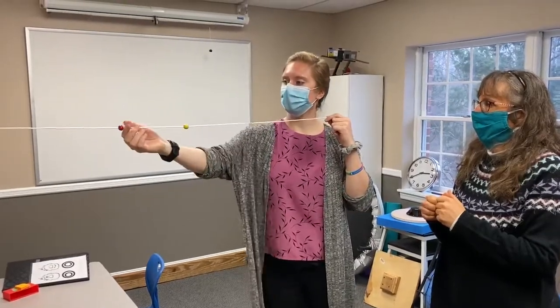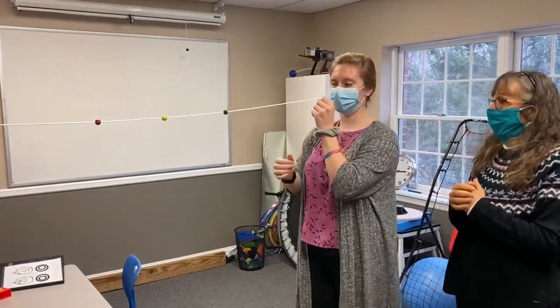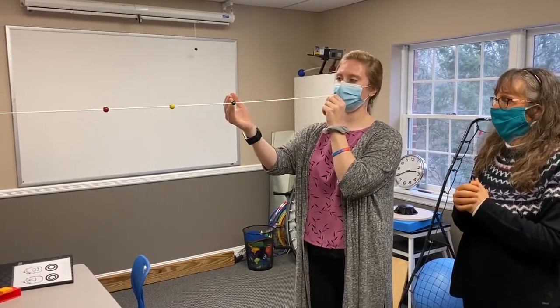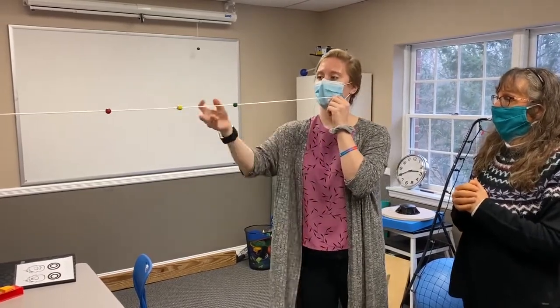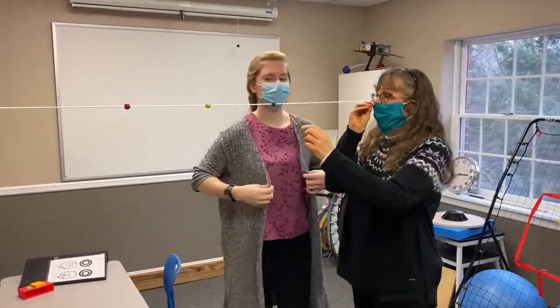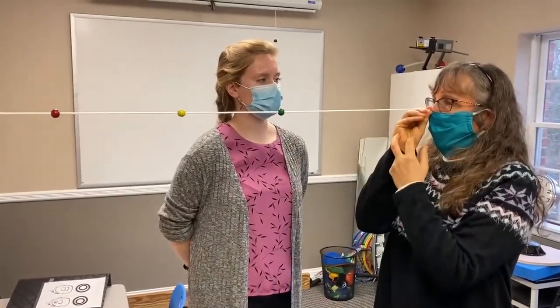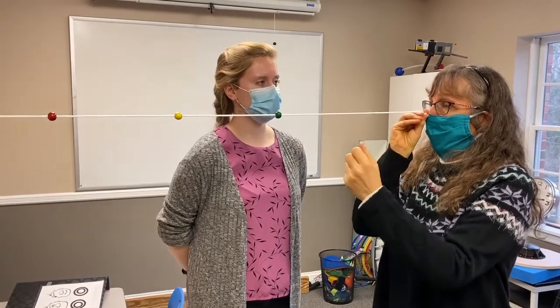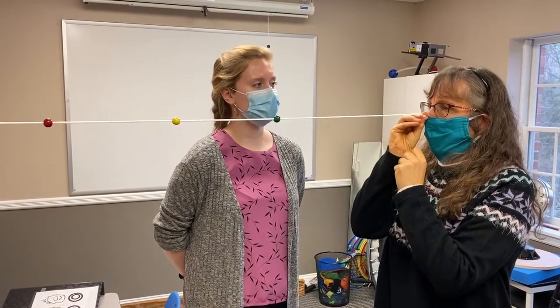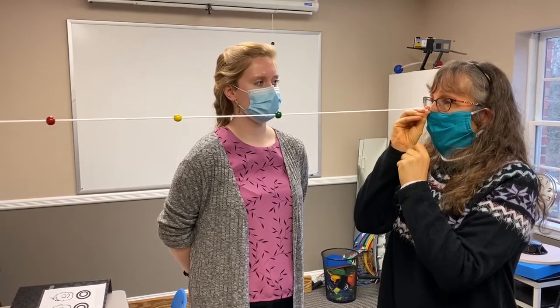Start about two feet away from you — hold this with your fingers and put your thumb up to your nose. Try to look right at the beads. If you're looking at the green bead, how many strings do you see going into the green? Two. And how many are leaving? Two. How many yellow beads do you see? Two. And how many red beads? Two. Perfect.